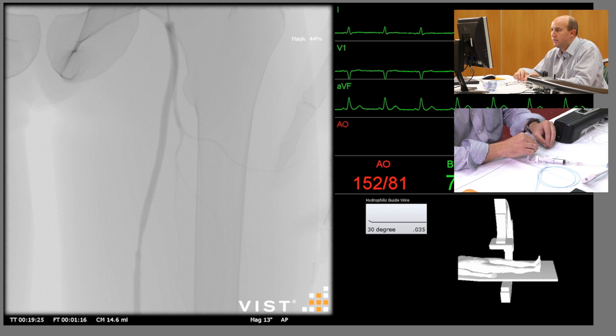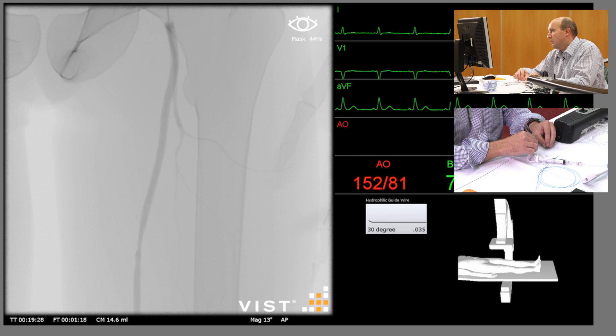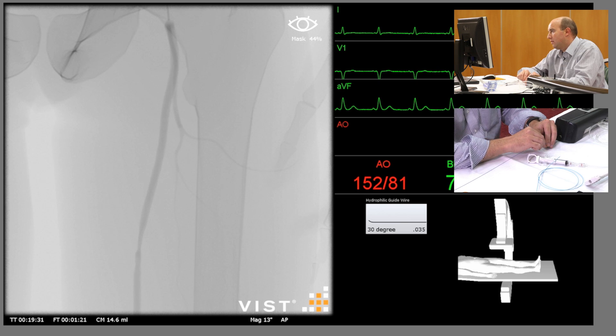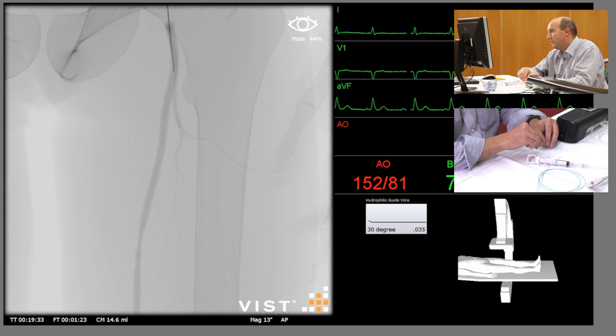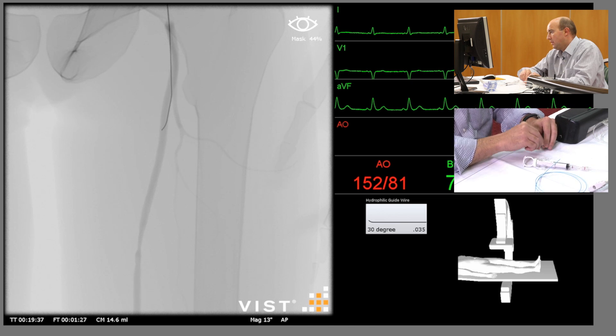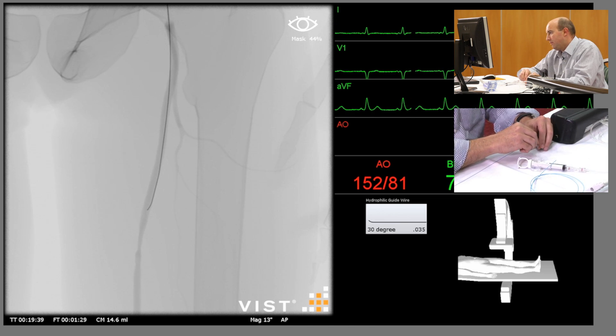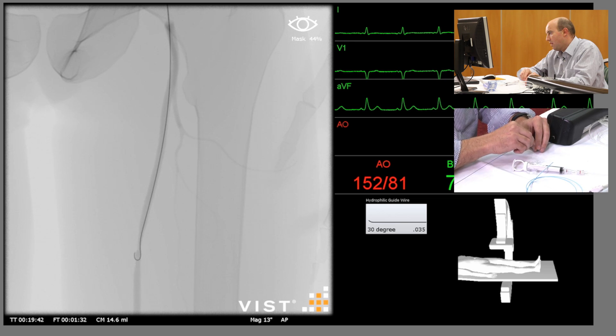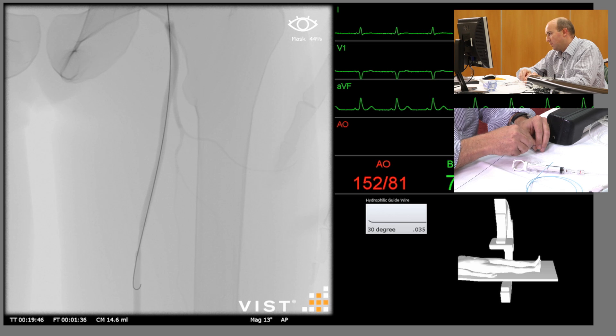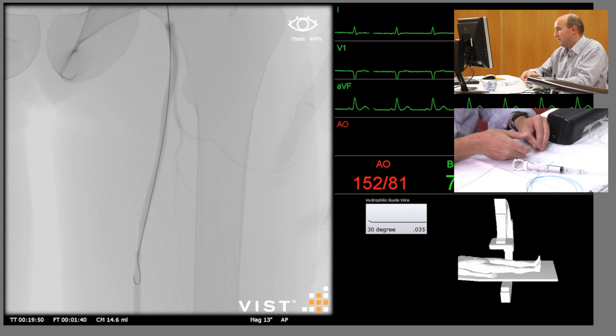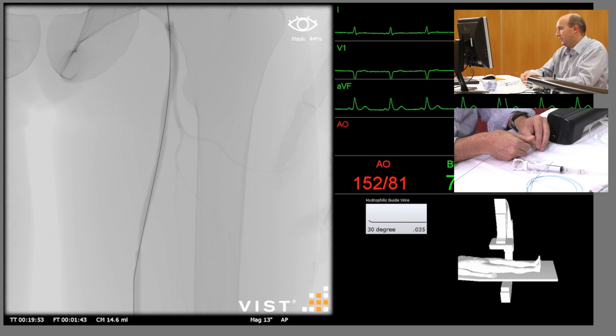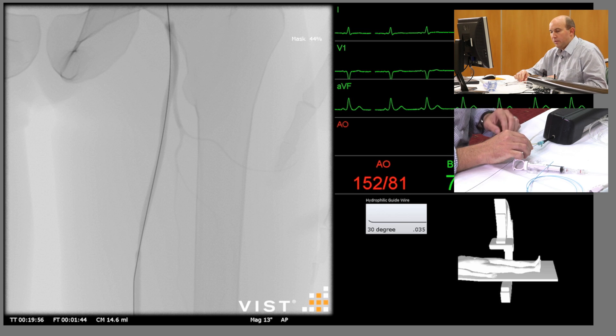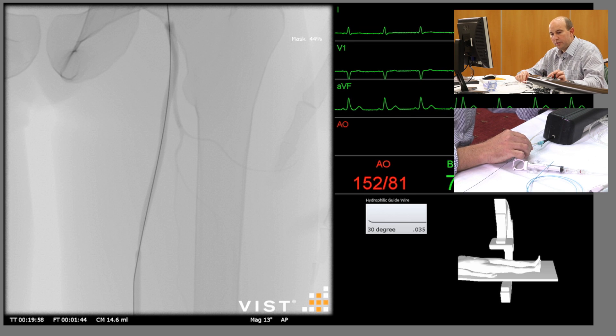And there you can see it's actually engaged. So at this point you could start screening and expect very shortly to see the wire move down the SFA. So now we're screening and there's the wire. Advance it without trying to loop the wire, negotiate the lesion, and always try to keep the wire, the tip of the wire, at the bottom of the screen.